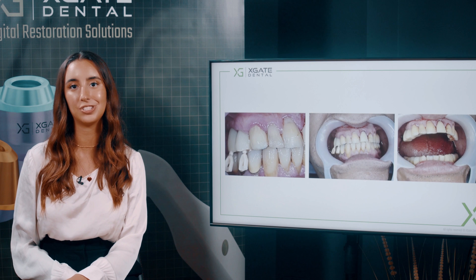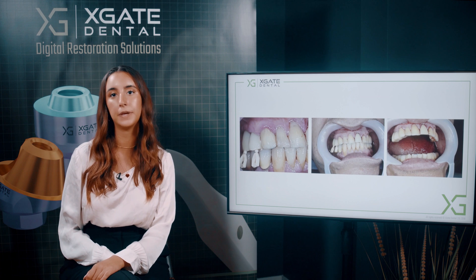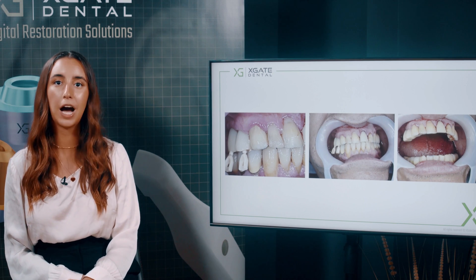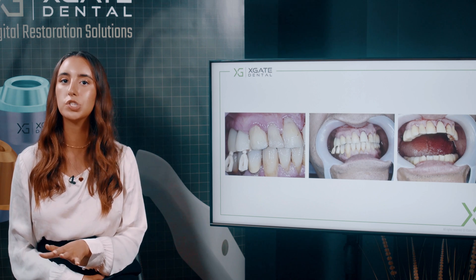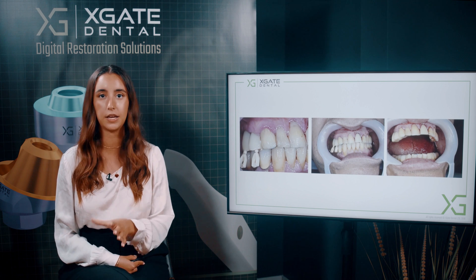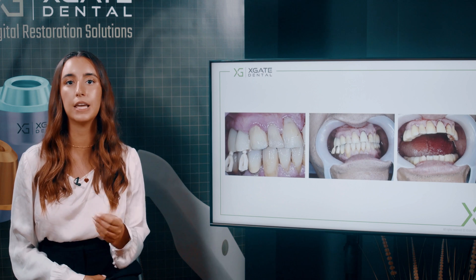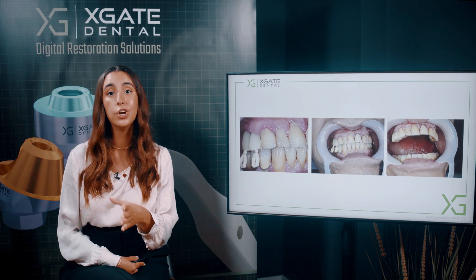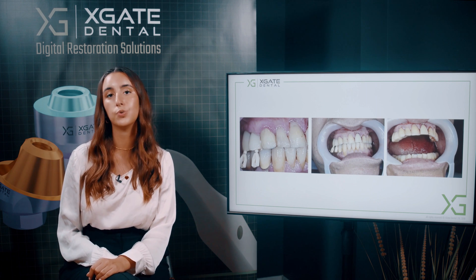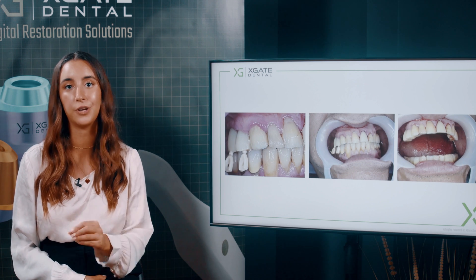When we're taking off these crowns to restore the missing tooth, we just return the old crowns back. Here you can see the temporary restoration — we have those two crowns restored upon, and we closed the whole gap with PMMA, no problem at all. We made an exact copy of tooth 11, but took a little bit off the occlusion so it wouldn't interfere with its movement, because you don't want it to move or break. The tooth is a little bit shorter, same as with a Maryland bridge.